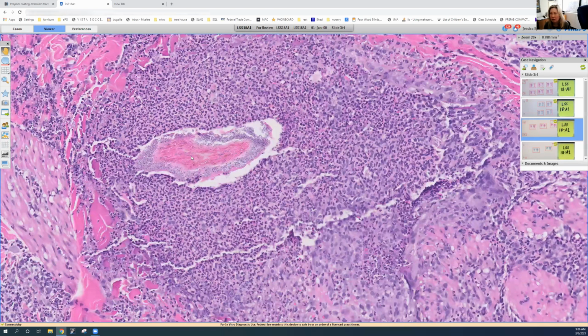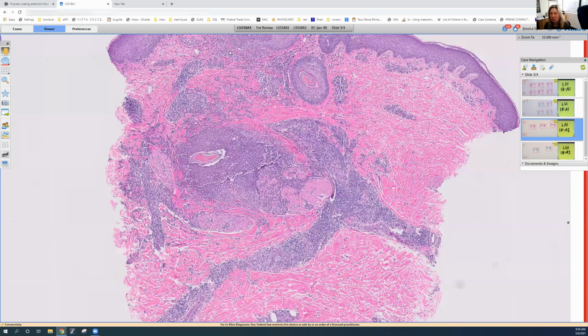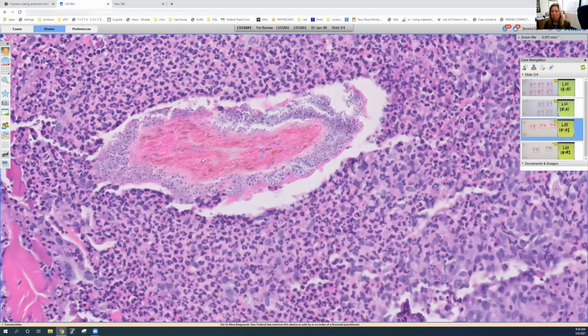This is dermatophyte infection with a suppurative folliculitis, or Majocchi's granuloma. When you have the dermatophytes surrounding the hair shaft, that's ectothrix. When you have them within the hair shaft, that's endothrix.